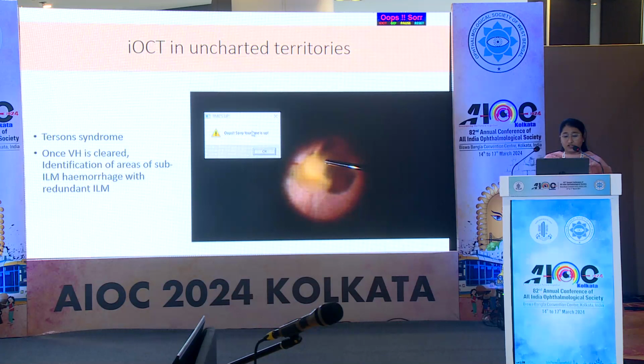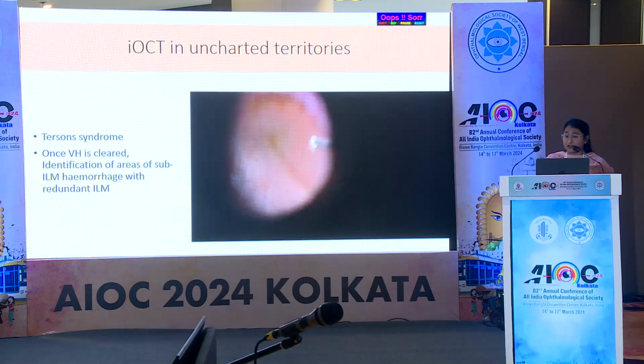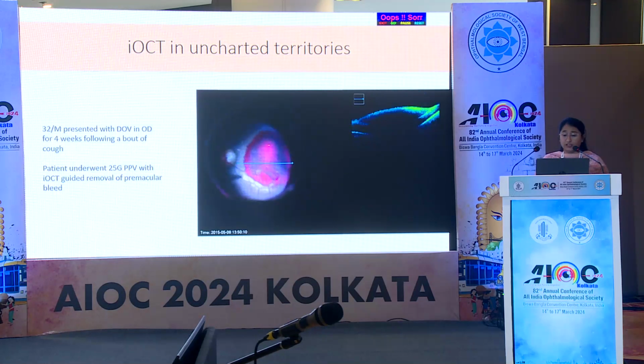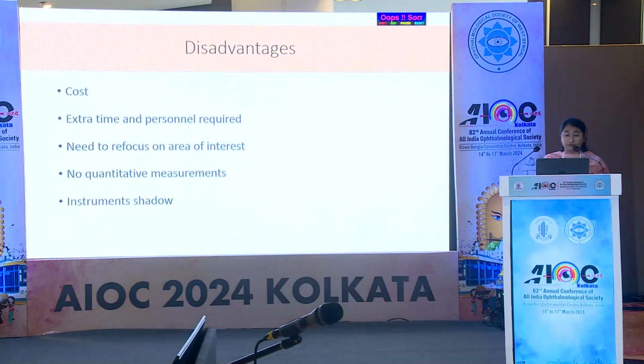Similarly, in another patient with Terson syndrome, once the vitreous hemorrhage was cleared, we could identify the area of sub-ILM hemorrhage that had occurred previously. Similarly, for premacular hemorrhage and bleed, we can use an IOCT guide to understand the exact layers at which.